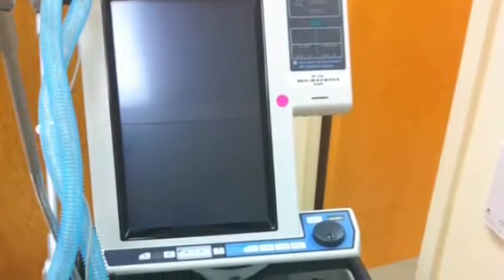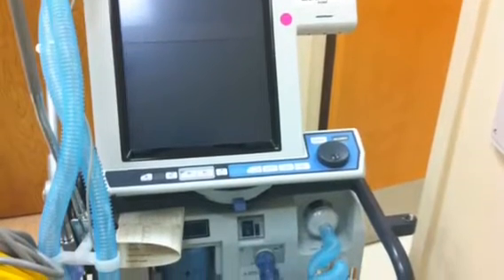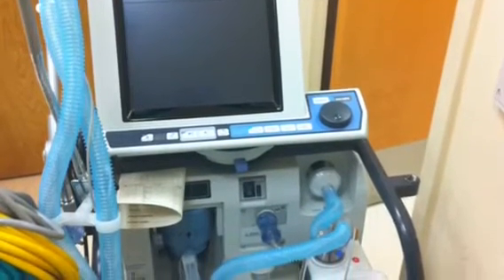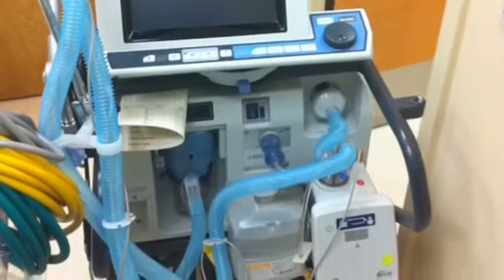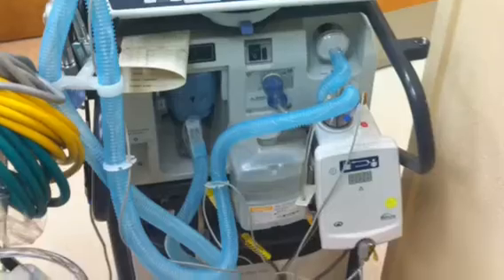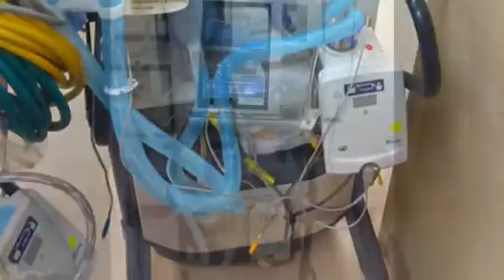Hello everybody, this is Chris with the Ancient Scholar. This is a quick video on the basic external characteristics of the PB840, and I'll take you through how to do a basic patient setup on the PB840. This video assumes that you have some basic knowledge of mechanical ventilation and does not go into advanced concepts.